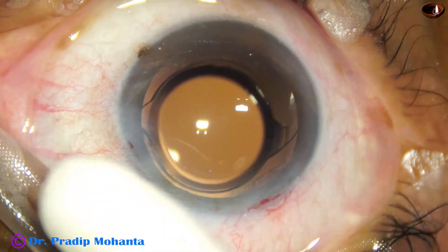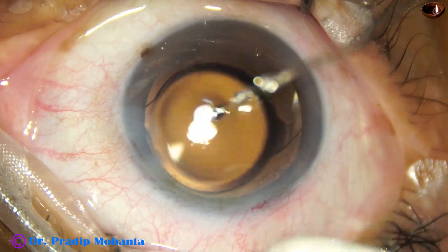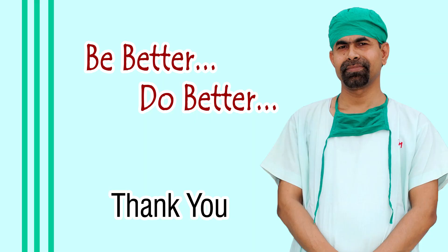A few drops of Moxifloxacin are applied over the ocular surface and the case is concluded. Thank you very much for your attention. Hope this video will help you in developing your surgical skills — be a great surgeon and serve your patients with love, respect, compassion, and great surgical competence.